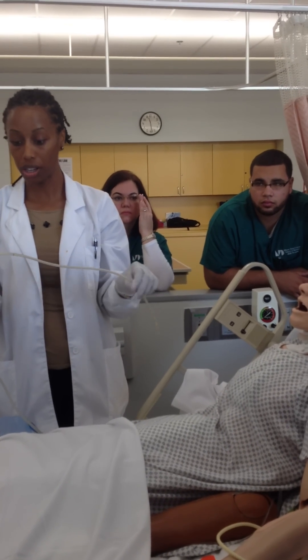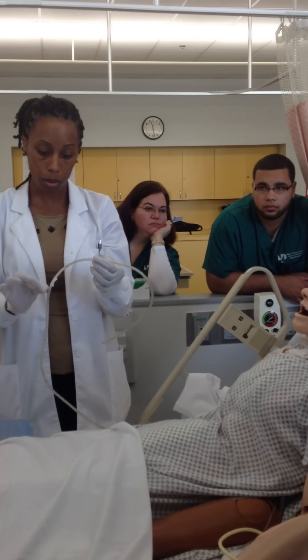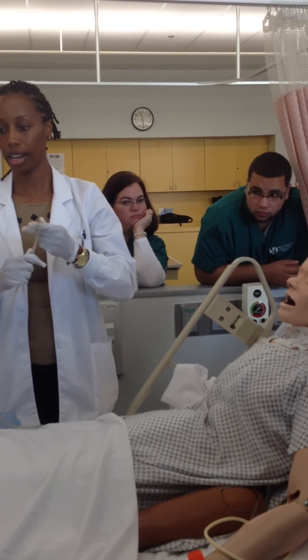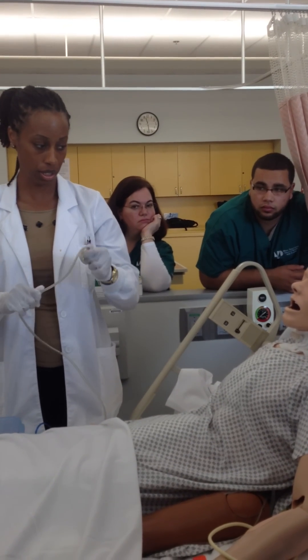So you don't stop before that mark. If they're saying they can't take it anymore and you're not there yet, you need to go in just a little bit more — you at least need to reach that mark. So you have this in your hand, you're going to coil it around, because this will be stiff in the packaging. You're coiling it so it's more flexible.